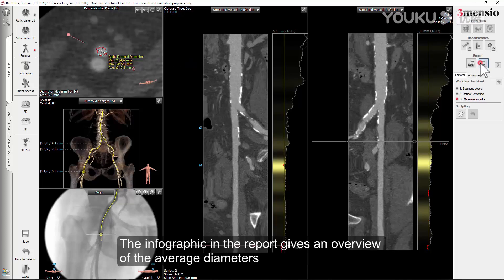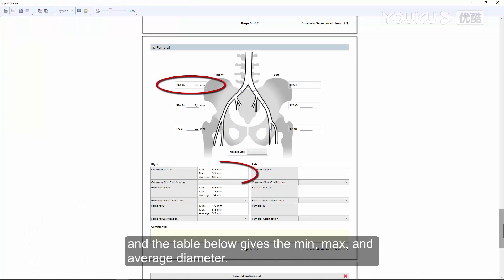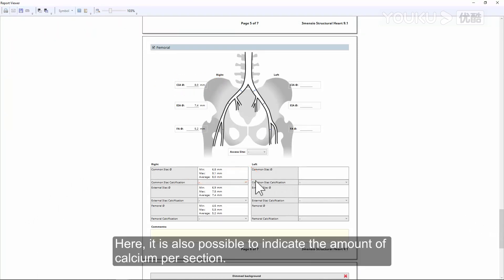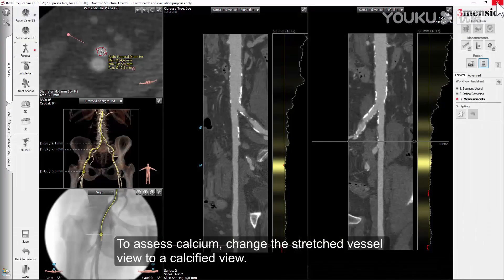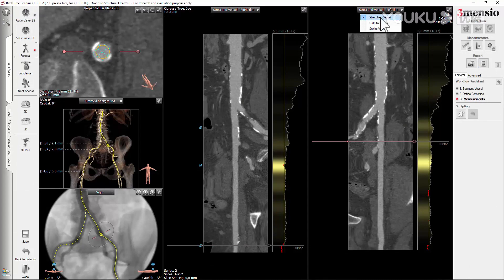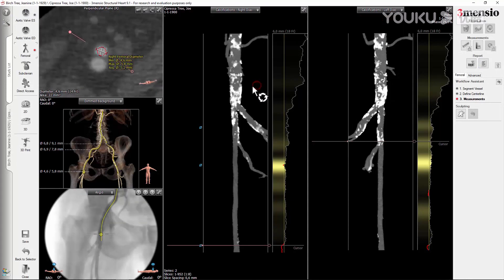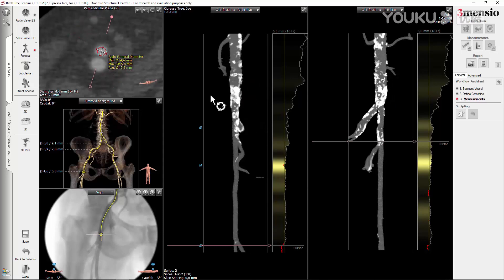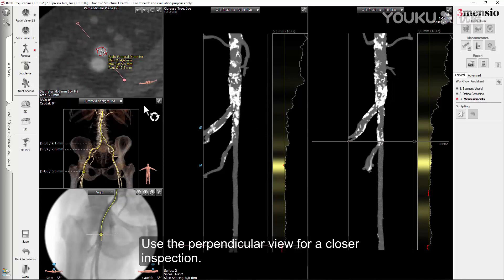The infographic in the report gives an overview of the average diameters, and the table below gives the min, max, and average diameter. Here it is also possible to indicate the amount of calcium per section. To assess calcium, change the stretch vessel view to a calcified view. Rotate for an overall view, and use the perpendicular view for a closer inspection.